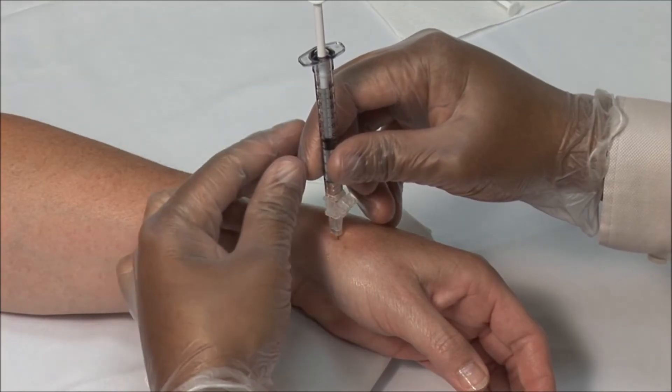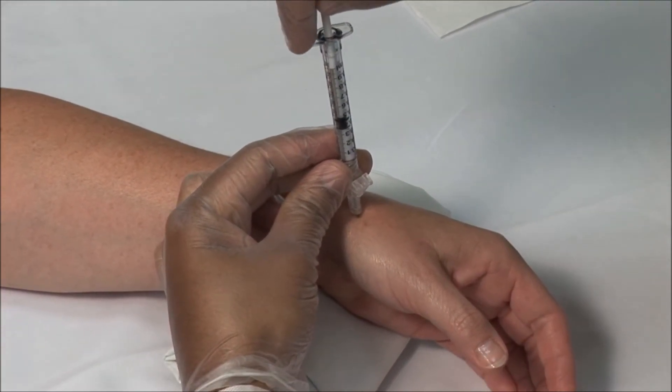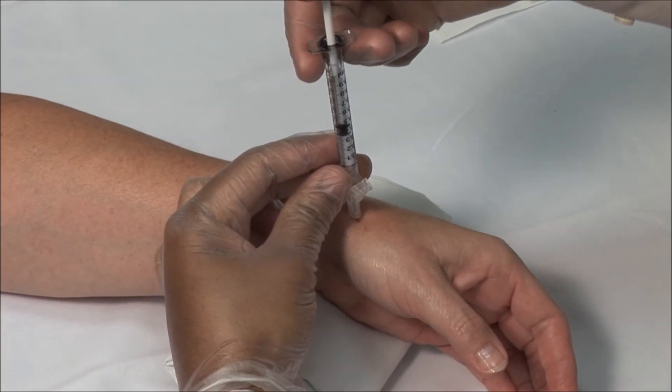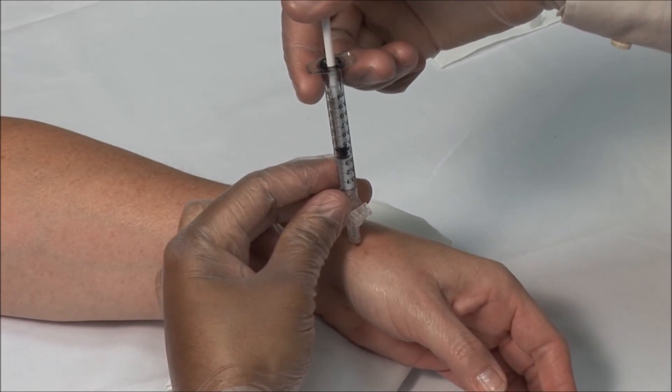Aspirate to ensure that you are not in a blood vessel. Then inject the solution. It should go in freely. If there is any resistance, slightly withdraw and adjust the needle.